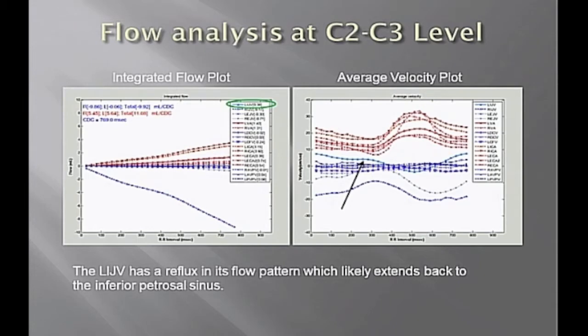But I want to show you that here's the vein that actually is fed by the petrosal sinus. It has positive flow, negative flow, positive flow. And that means that you're going to have that same reflux in the petrosal sinus. And now what's the petrosal sinus draining? Many of the small vessels in the interior of the brain. So if you have this backwards flow, it's exactly what Paolo Zamboni has said using ultrasound, that he can see reflux in the petrosal sinus. He can see reflux in the ophthalmic veins. Now, we haven't measured that in the past, but in practice, we could go in and try to do that.